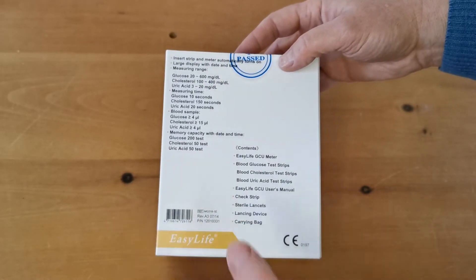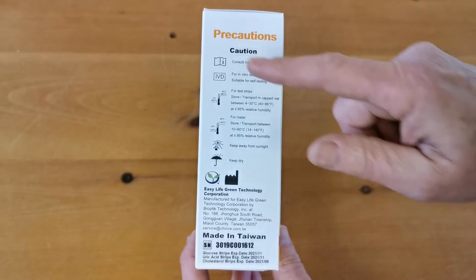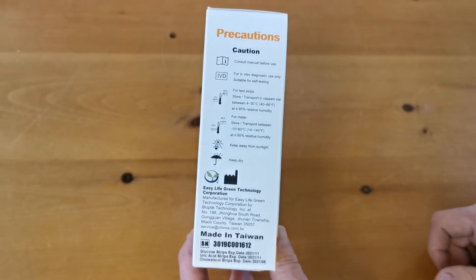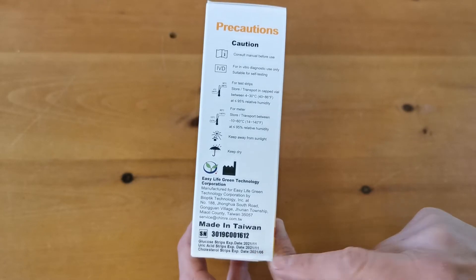The pack is barcoded on the back — if you're buying from Amazon, it will have a barcode specific to this product for the Amazon FBA. You'll also see the CE certification and IVD logos on the side. Note that the test strips in these starter packs do have expiry dates on them.